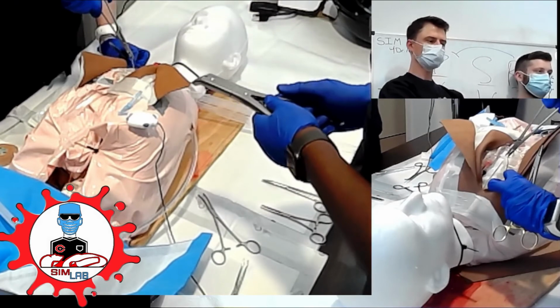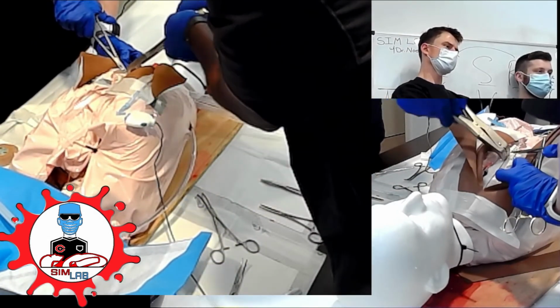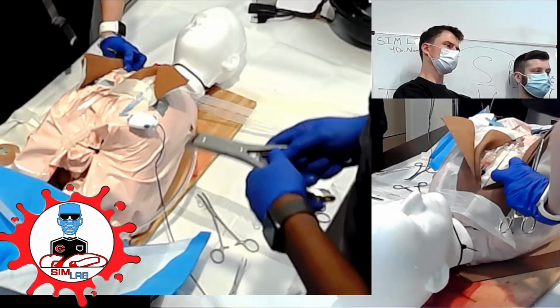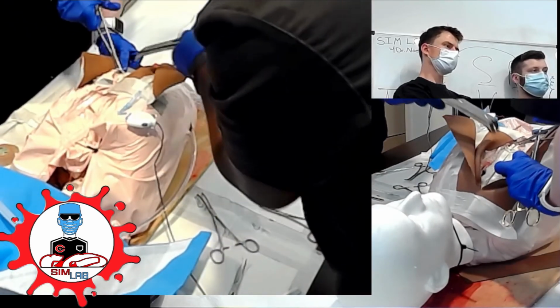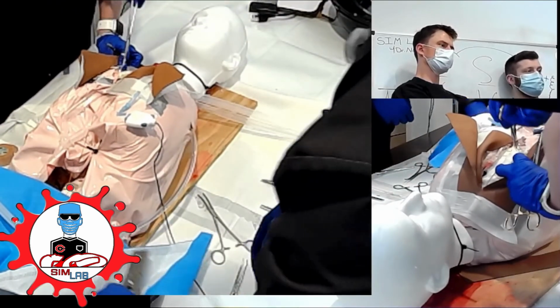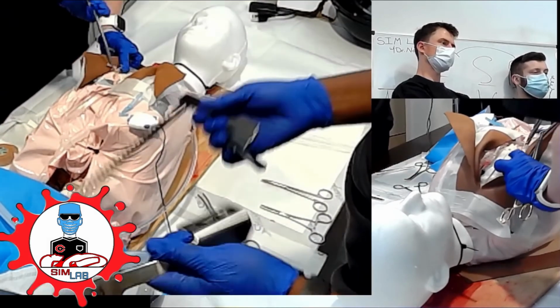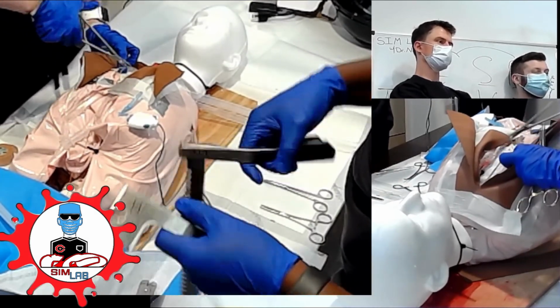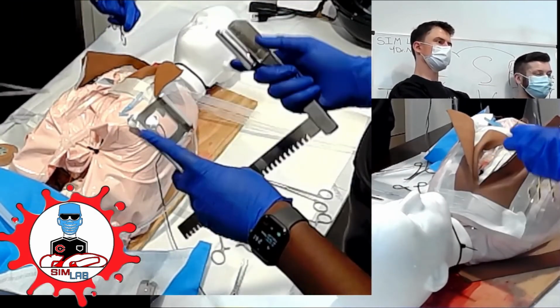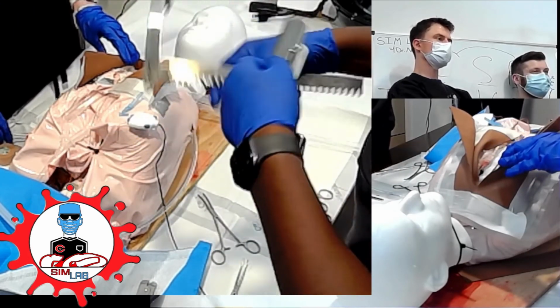Generally speaking, it's pretty easy to get in the chest. It's just having everything in front of you and then the willpower to proceed, right? And knowing that this is a time-dependent intervention and it's indicated. If you're a medical person like me who spent their lives dealing with molecules, getting over that initial inertia to open the chest, I think, but also having an understanding about what's going on. Again, where do you think the hole is? If you do open the chest, can you fix the hole?